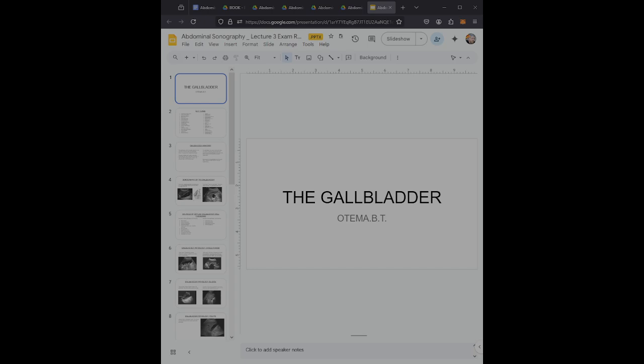Just a reminder, this is lecture number 3 in the abdominal sonography series. So today we're going to go over the gallbladder. We're going to look at what the gallbladder is, some key terms, as well as certain pathology.